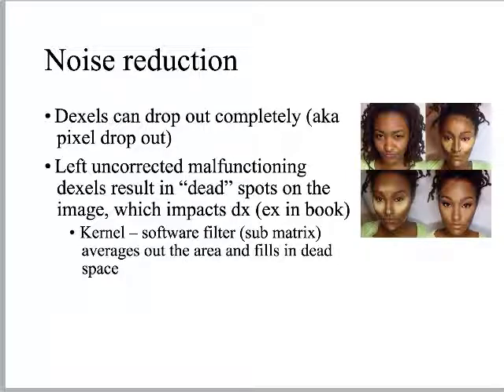But her thoughts, the reason she's doing this, are the same reasons why the computer scientists came up with these noise reduction algorithms, right? They've recognized that to actually get rid of the noise, we have to be thinking about what the end product is going to look like, right? Because some of the transformations we're going to go through are going to look really weird, right? So the same thing is happening here with preprocessing in terms of reducing the Dexel dropout.